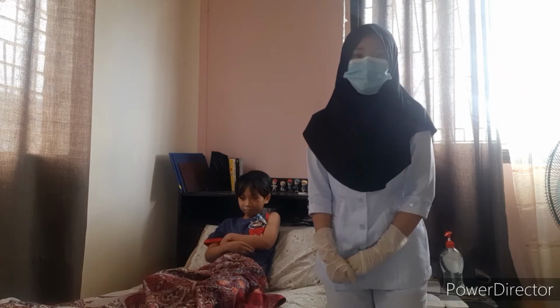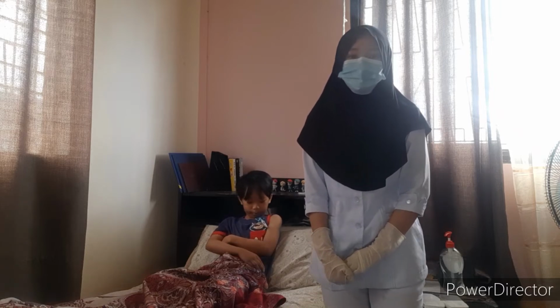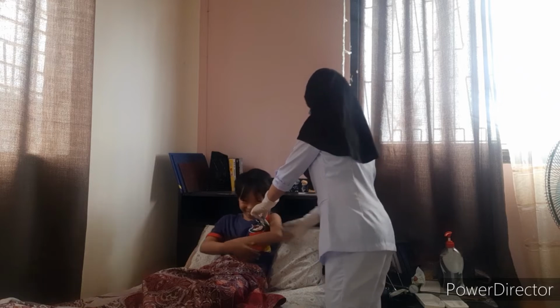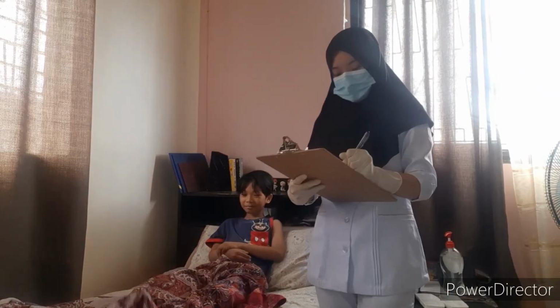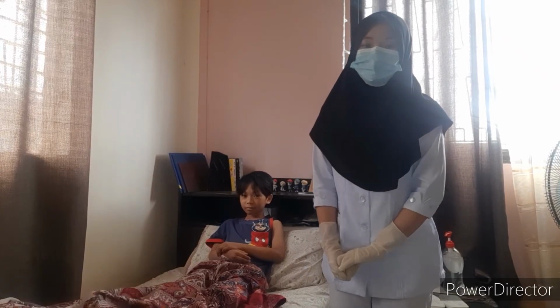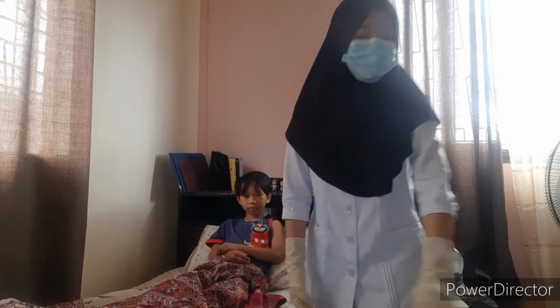So wait for at least a few minutes until the thermometer beeps with the reading. So this is to provide sufficient time for the recording of the temperature. So for better accuracy, take readings from both armpits and then average the two temperatures together. So this is to ensure accurate readings. Sir?